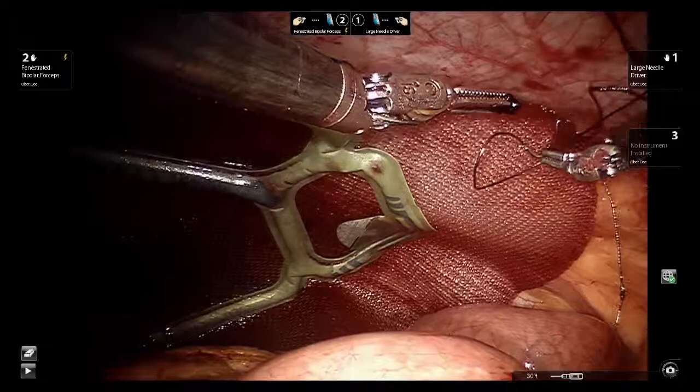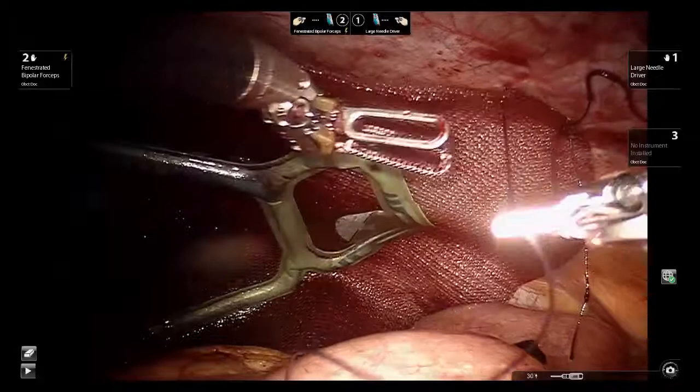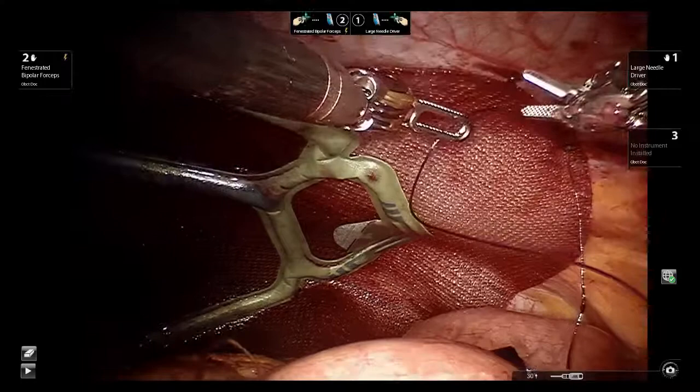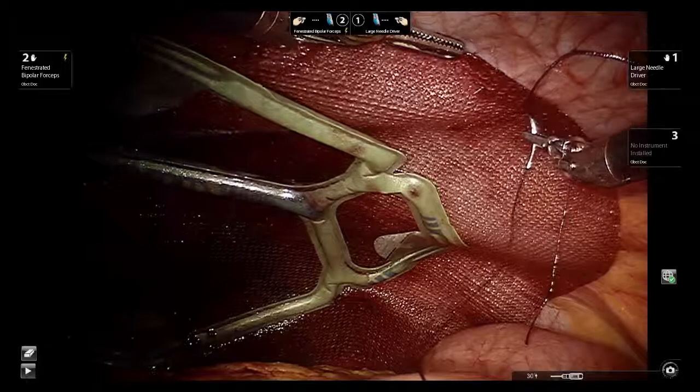Utilizing a technique learned from one of the surgeons on the CRSA website, it was now possible to suture the mesh to the anterior abdominal wall in a much faster and more efficient manner by simply running the suture instead of as a baseball stitch, to run it as a running stitch. And as one will see, it still allows for the mesh to be completely attached to the anterior abdominal wall.